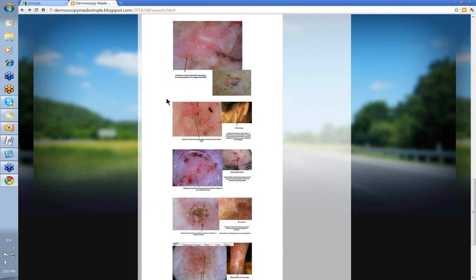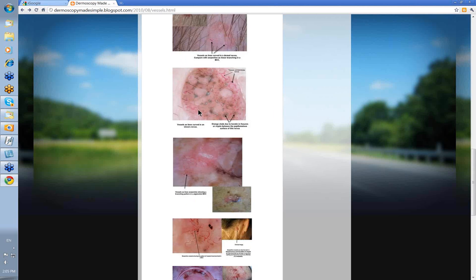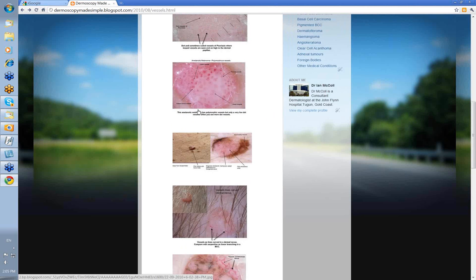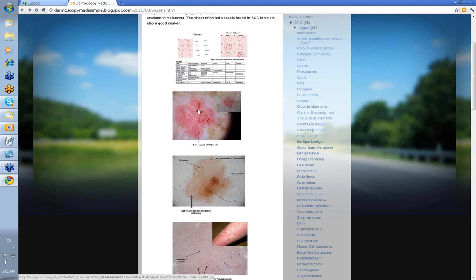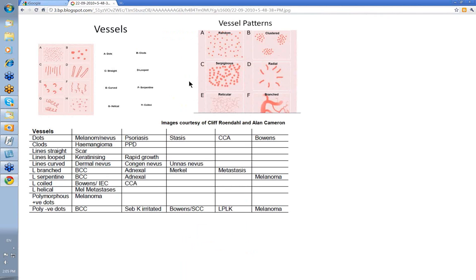So, vessels — there's a lot in vessels and they're not terribly specific. It's useful just to go back to the very beginning and remember how to describe the vessels, and remember the various diagnoses that can be associated with them. If you do that, I think you'll find vessels of some value when you're looking at both pigmented and non-pigmented lesions with the dermatoscope. Thank you very much.